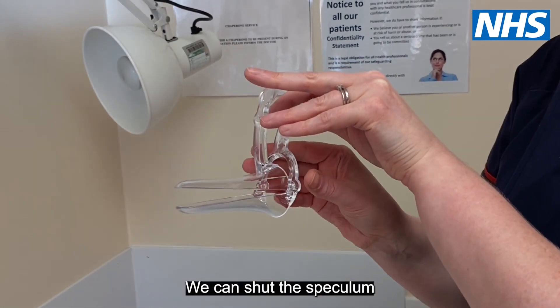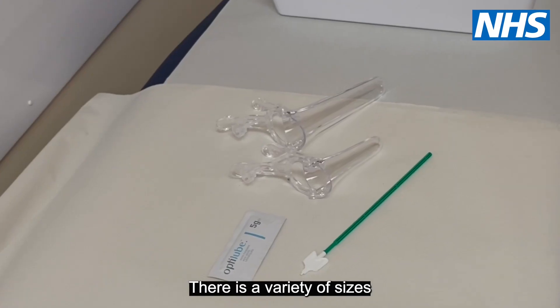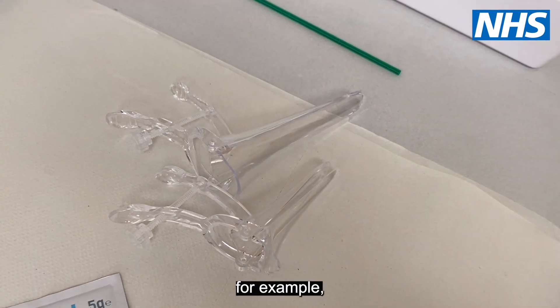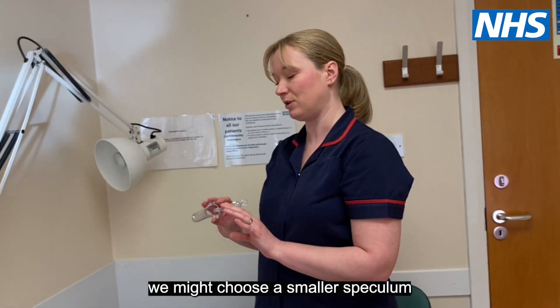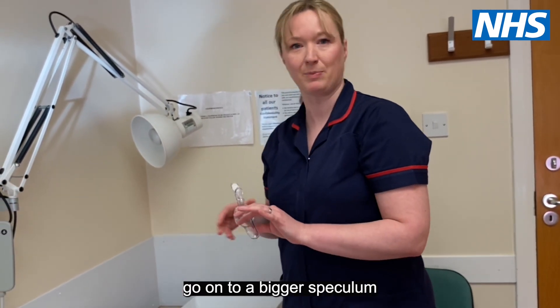We can shut the speculum and remove it. There is a variety of sizes and lengths of speculum depending on the patient. Depending on if it's her first smear, for example, we might choose a smaller speculum to begin with, and then move on to a bigger one if we need.